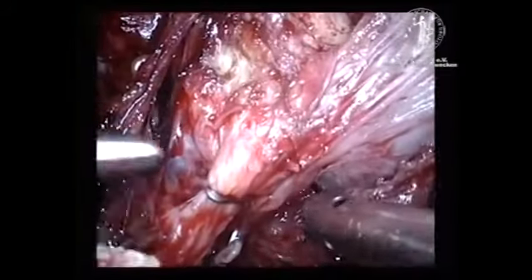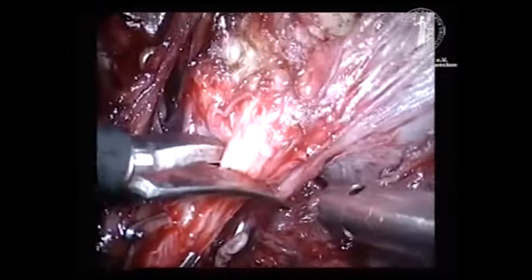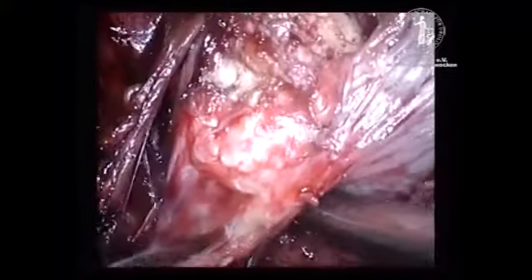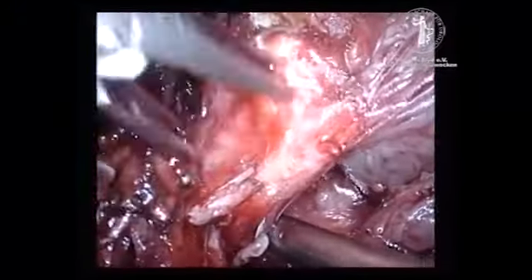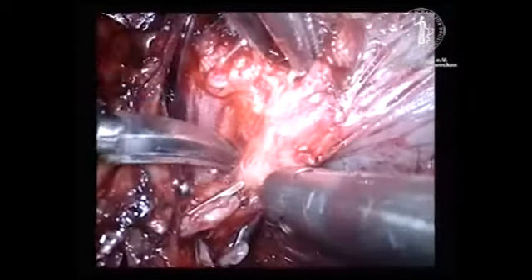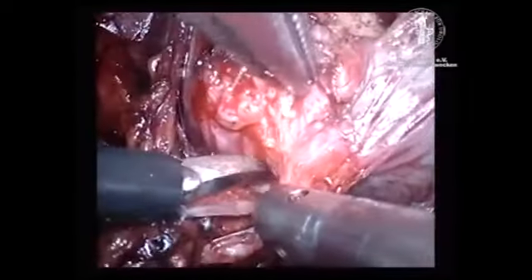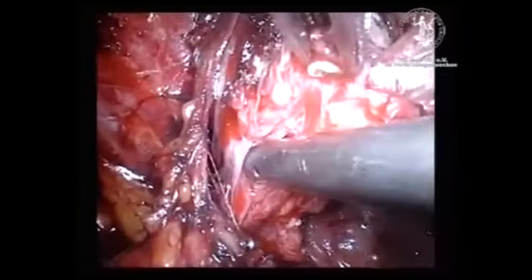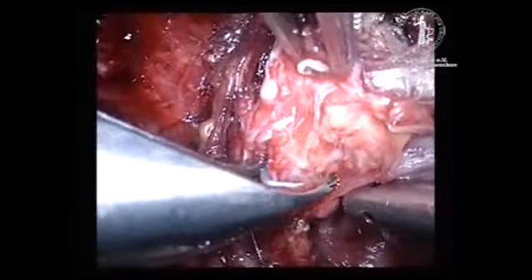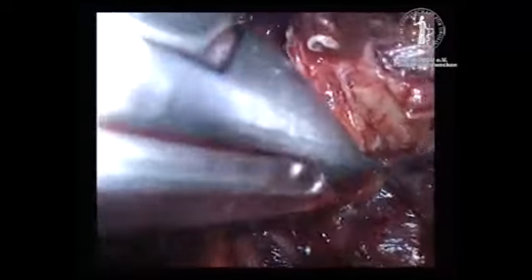For prostatic pedicle dissection, the assistant elevates the seminal vesicles ventrally, allowing clear exposure of the prostatic pedicle. The prostatic pedicle must be clipped and cut step by step. It is not possible to include the entire pedicle within one clip. It is advisable to proceed with clipping and cutting in small steps directly on the surface of the prostatic capsule.